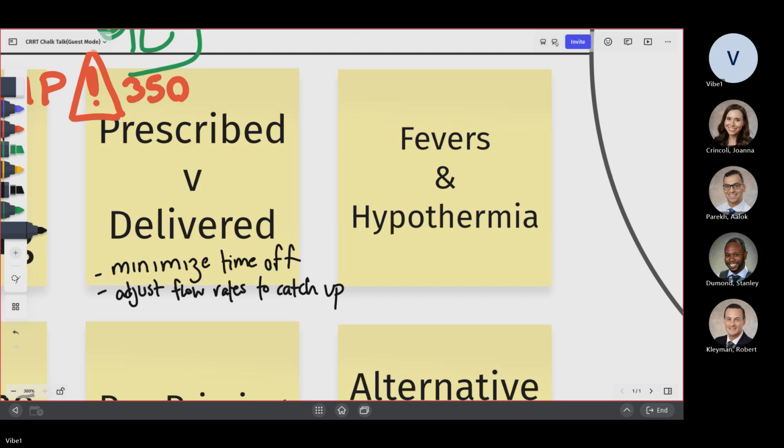That's why, because with the permacath, it's fixed. Number two is, if you leave the needles long enough, the chances of forming pseudoaneurysms are very high. That's why using the fistula or the graft is not recommended when you're doing continuous renal replacement therapies. Any particular site you can use, it doesn't matter whether you use the groin or the IJ. All the institutions have their policies regarding infection control. So long as you're maintaining a clean environment, the groin catheters can also stay for at least a week.